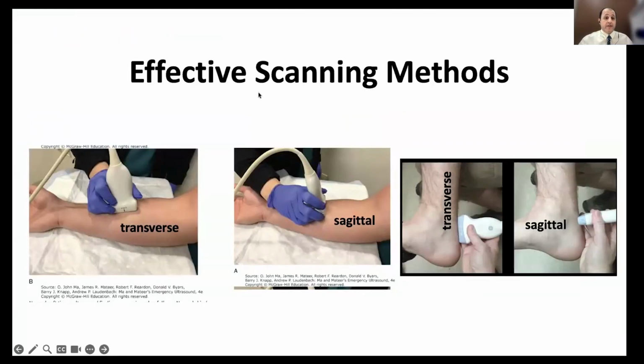Always when you are doing ultrasound, it is a rule in ultrasound, we need to check transverse and sagittal planes on both sides and scan and hold the whole lesion to not miss any part of it. Because if you find some abnormal finding and finish your exam soon, you may miss other pathologies also. That's why it is recommended to do a full ultrasound in both transverse and sagittal and map the whole lesion.